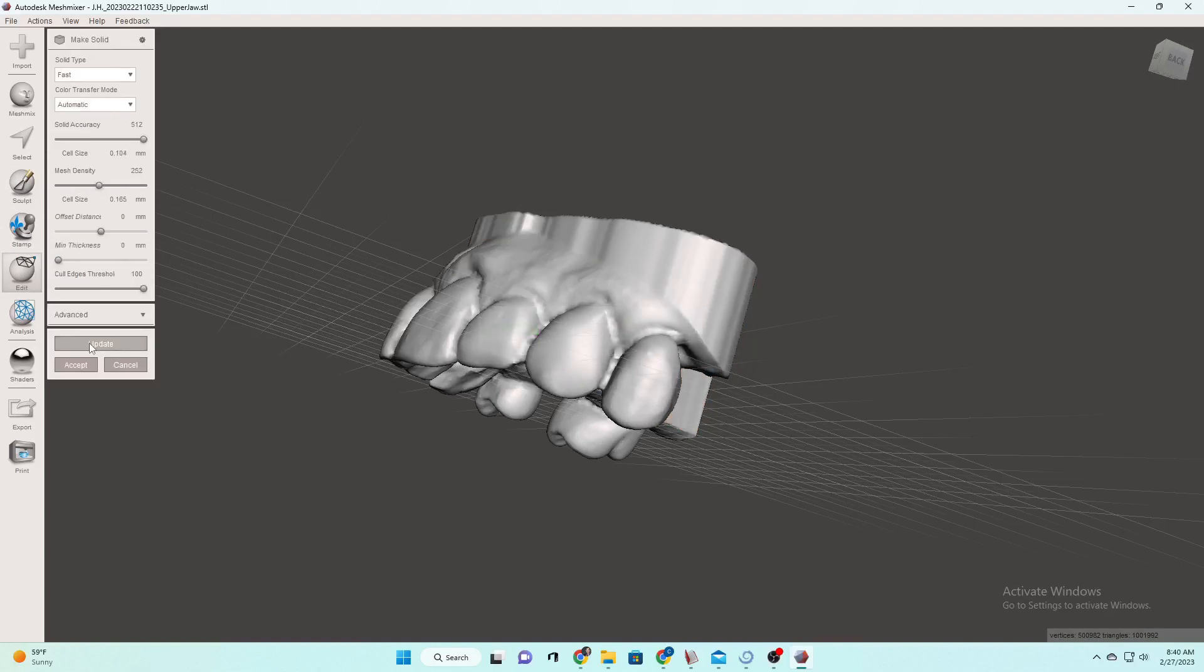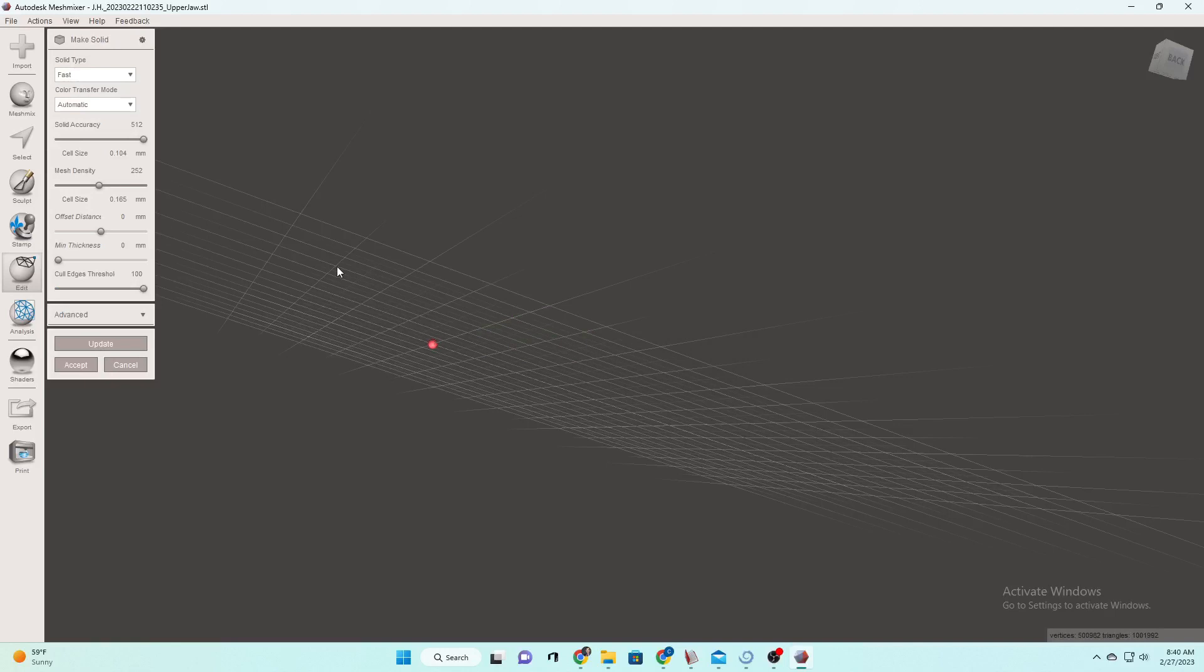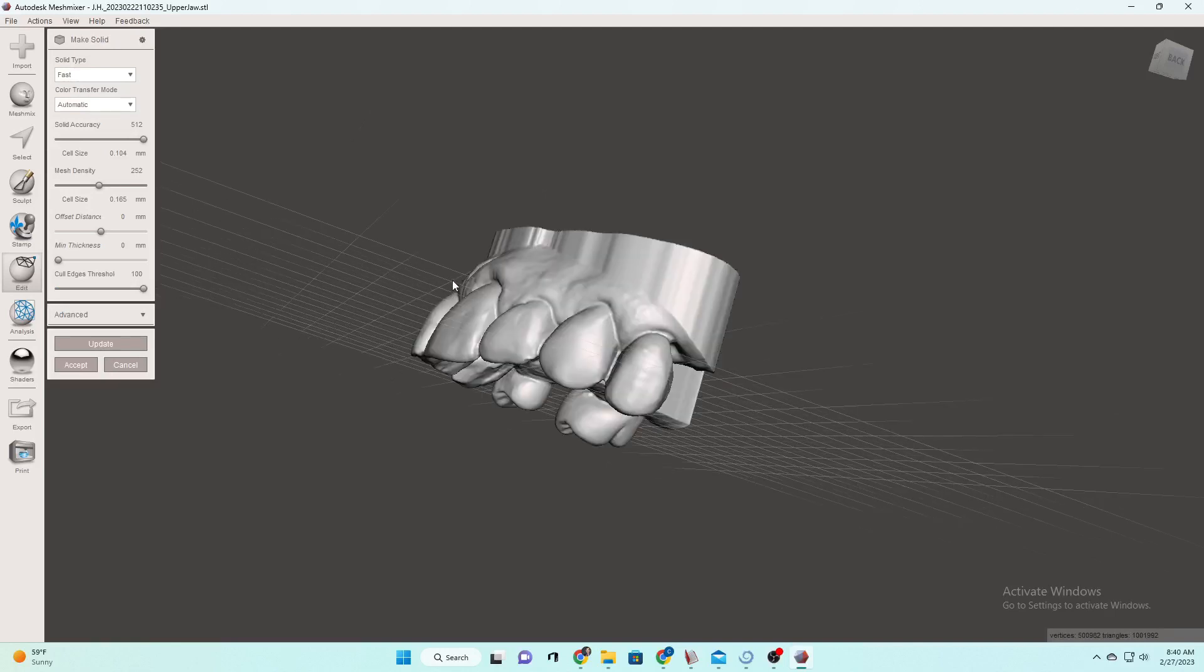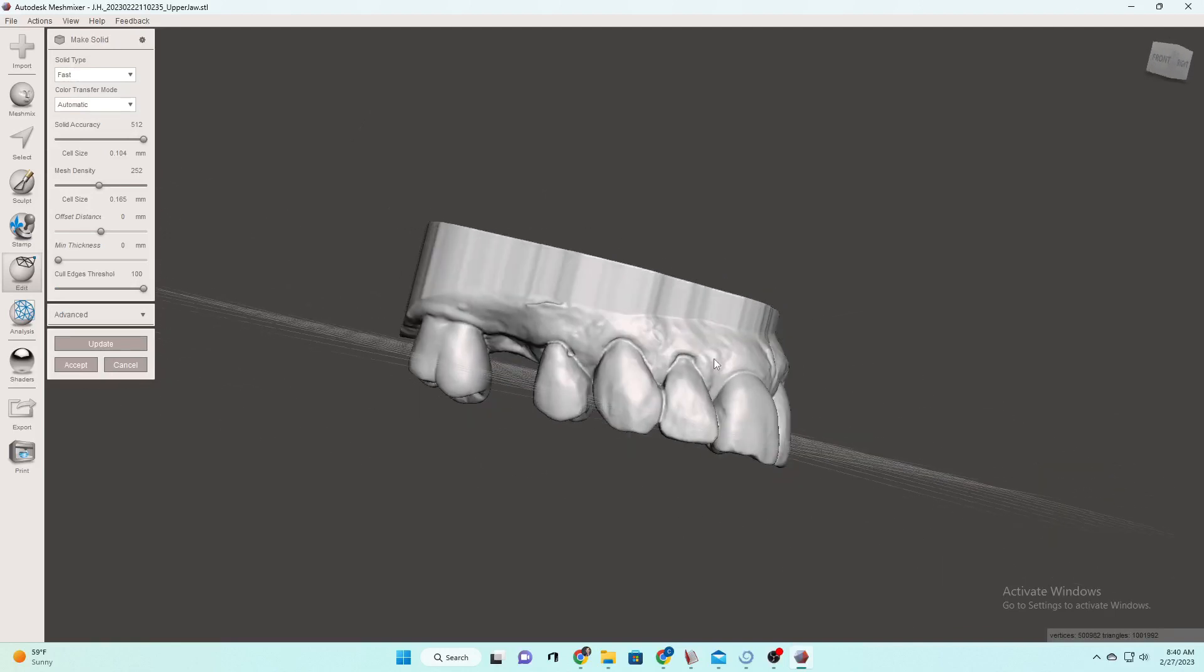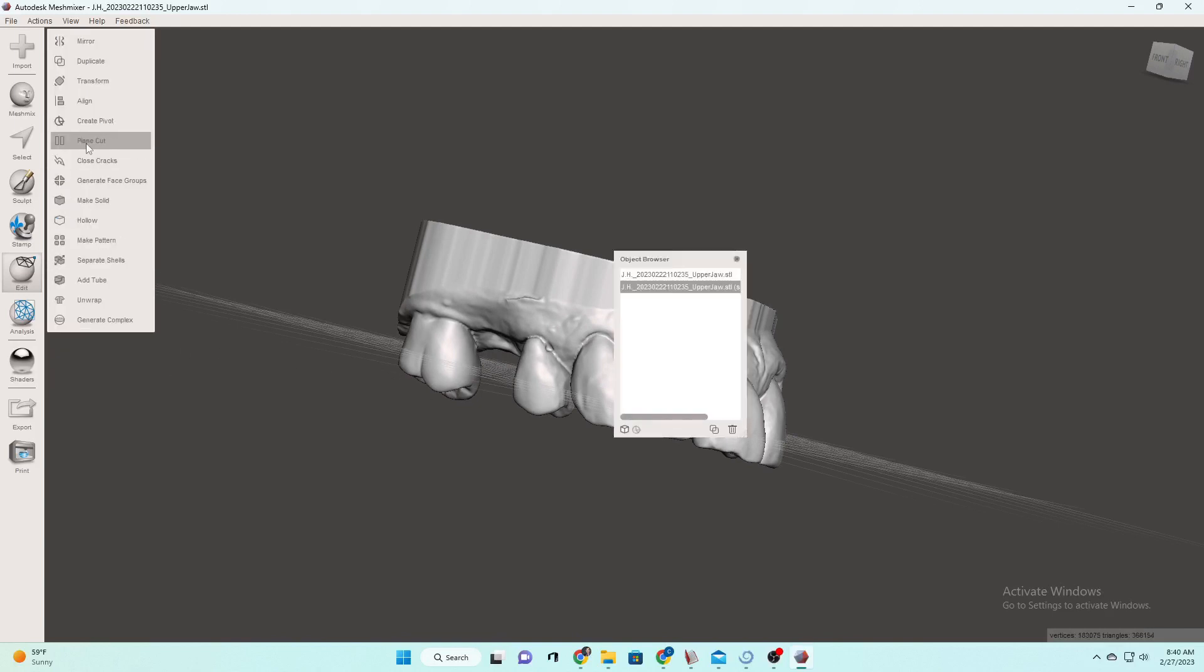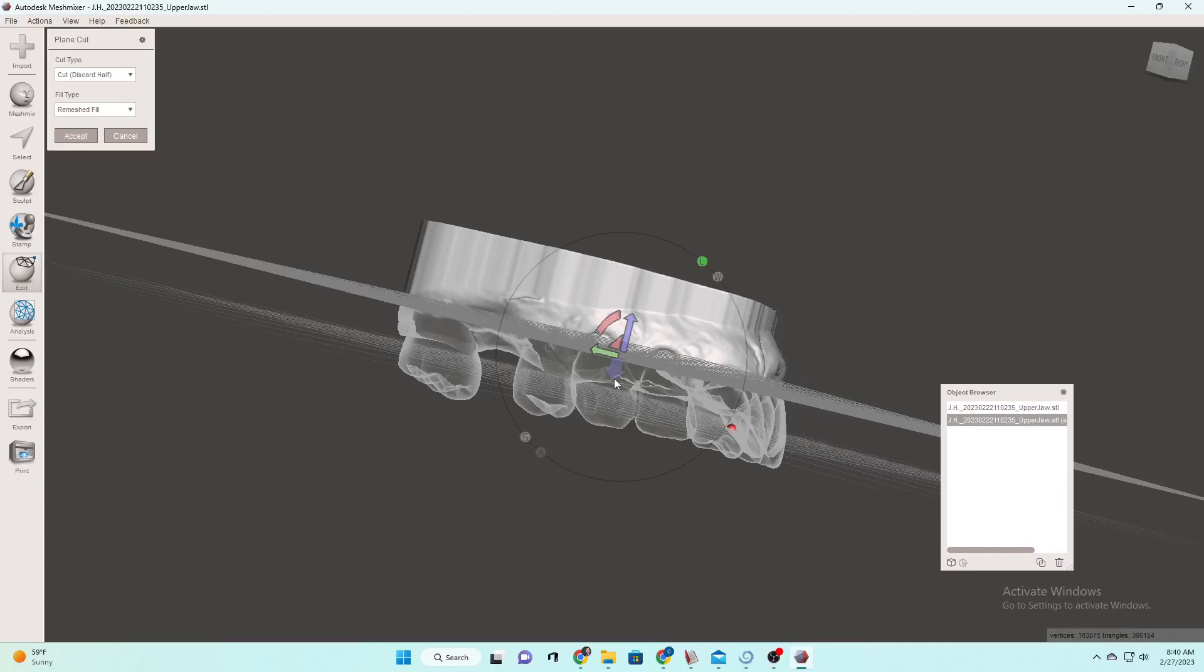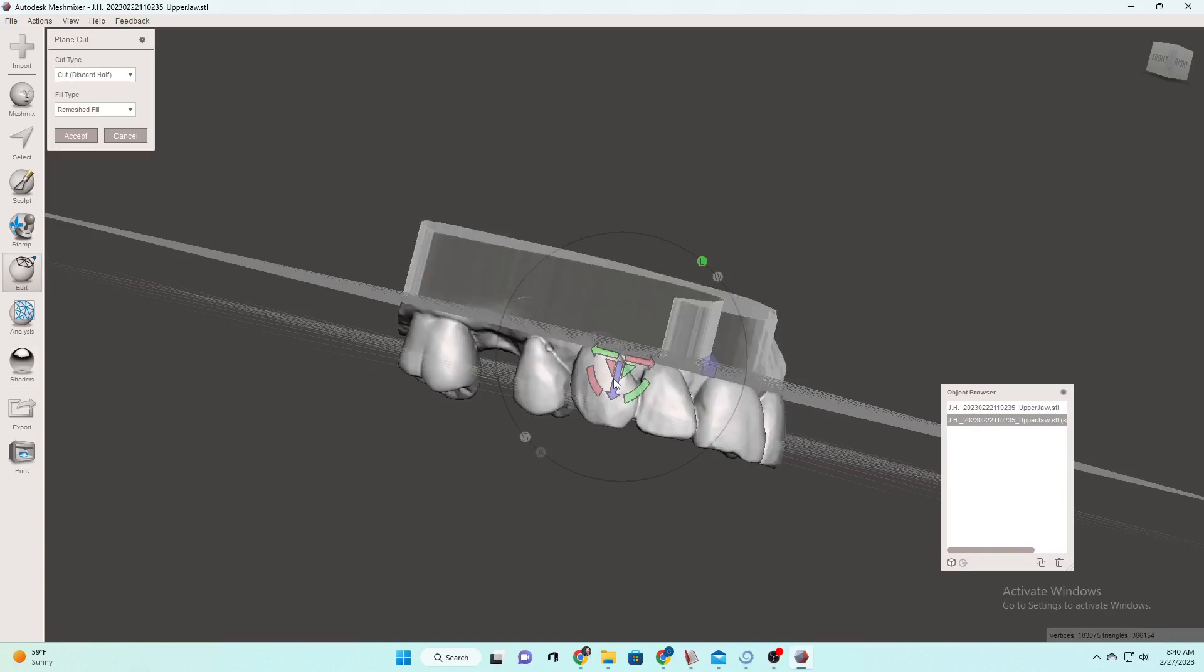Then you see that extra little guy. We're going to go to plain, we're going to go to make solid. When you make it solid, it's going to get that little extra pad it gave you that it does on the bottom. And it's going to make sure it doesn't try to print a hollow model. Some people print hollow models. I personally do not. So you always want to up that solid accuracy and mesh density.